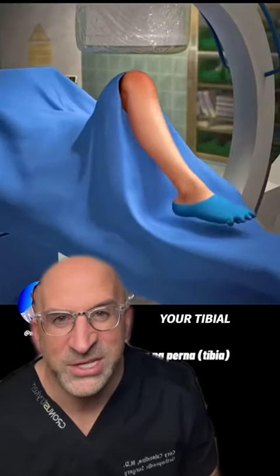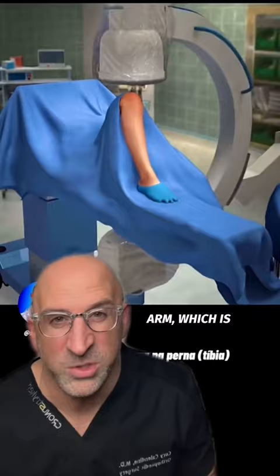This is how I would fix your tibial fracture. I'd take you to the operating room and use C-Arm, which is essentially live x-ray, to visualize the fracture.